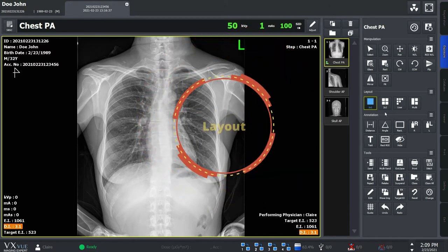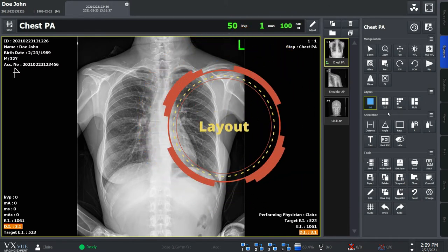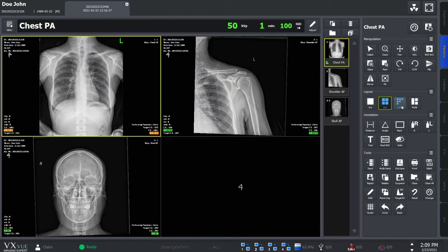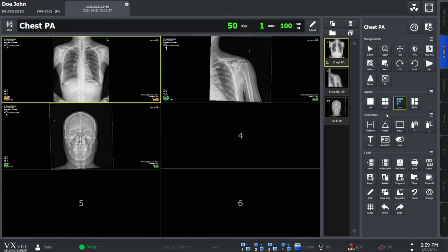VXView provides several layout options. You can choose the provided options here or choose your own layout here. Of course, you can customize which layout to show at the setting mode.